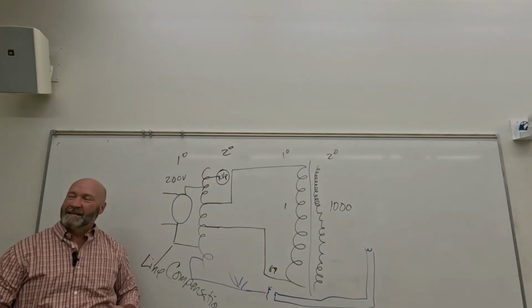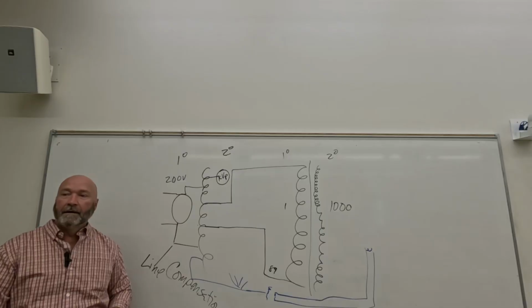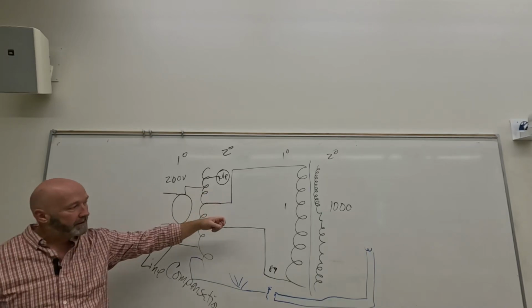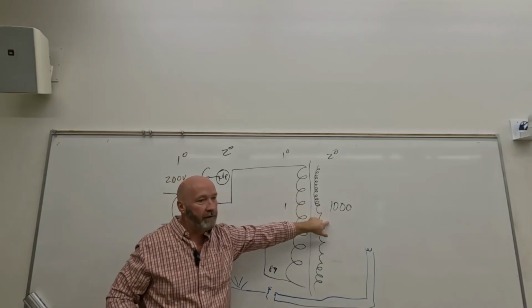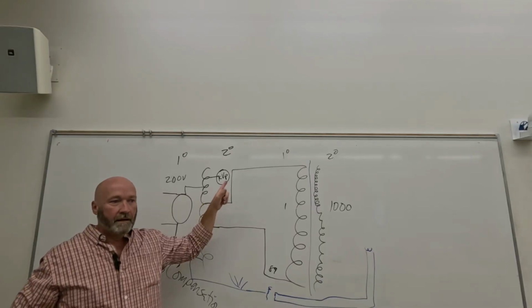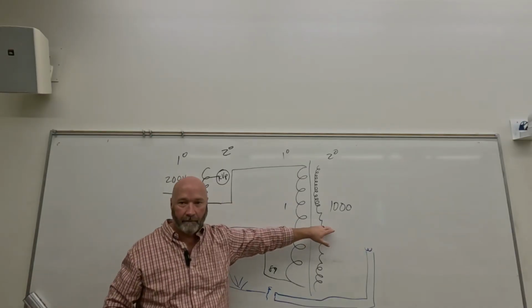It's just a hump to get over. It's not really a problem. You don't have kVp, right? So why are we going to call it a kVp meter? Because you're projecting how much you're going to have. Exactly, because this turns ratio is set. We know exactly how much we're going to have over here if this is right, and we're going to determine that that's right by looking at that. Does that make sense? So even though it's not reading kVp, it's reading what we're going to have. It's in anticipation of it becoming kVp.